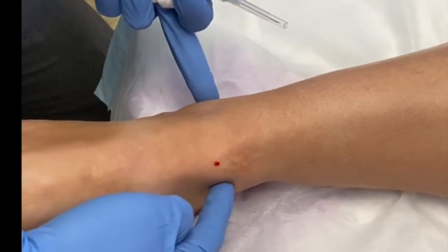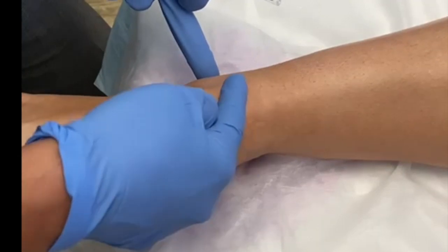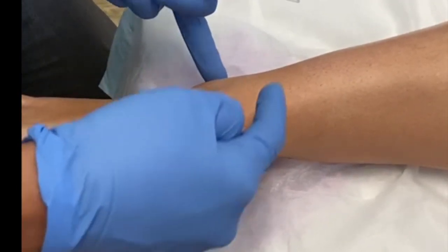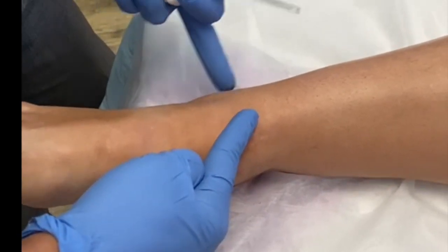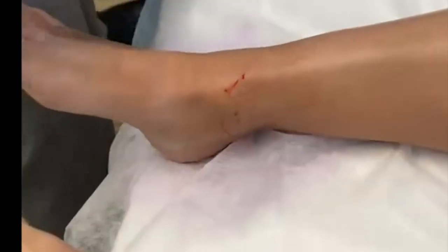From the anatomy, at the tip of the medial malleolus there's the medial gutter, the ankle joint, and the lateral gutter. You enter just at the level of the medial malleolus, pointing slightly upward at about a 45-degree angle. Here I've given some local anesthetic as you can see.